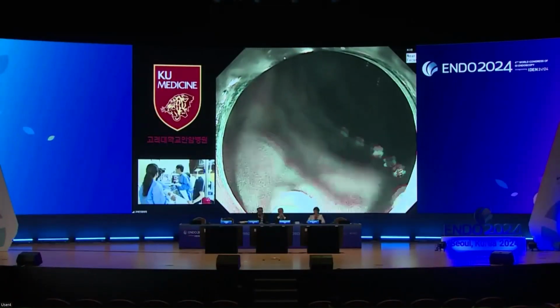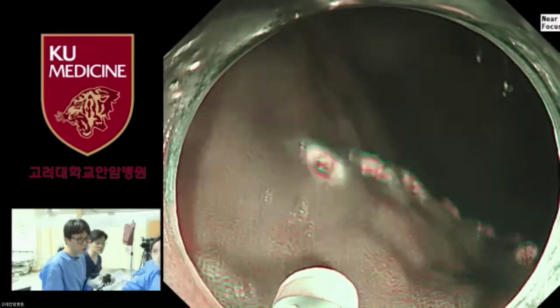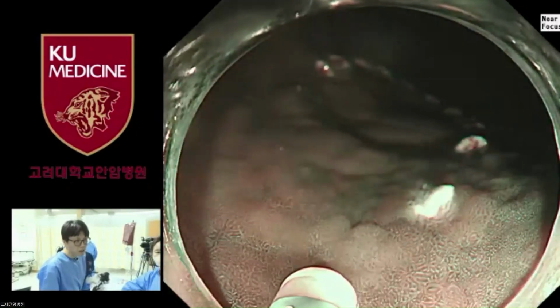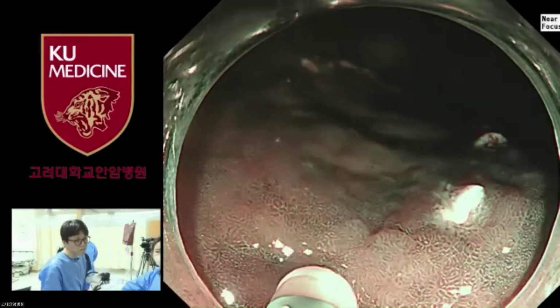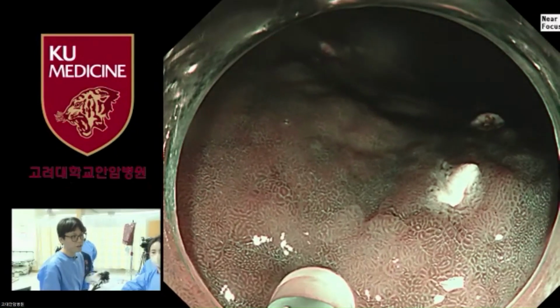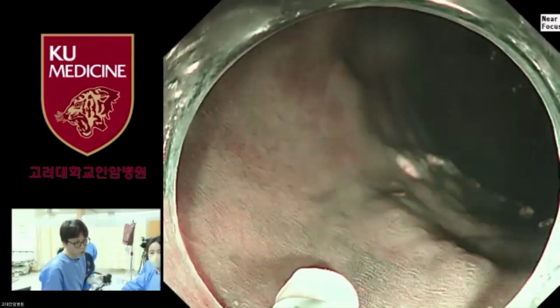Okay. Professor Jeon, when you decide the marking location, do you usually use NBI only, or other chromoendoscopy, before the marking? In my cases, I usually mark with only NBI because the NBI image accuracy with near focus is over 85%. So it is sufficient to use only NBI.